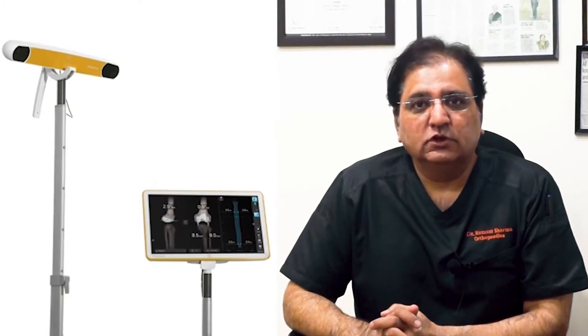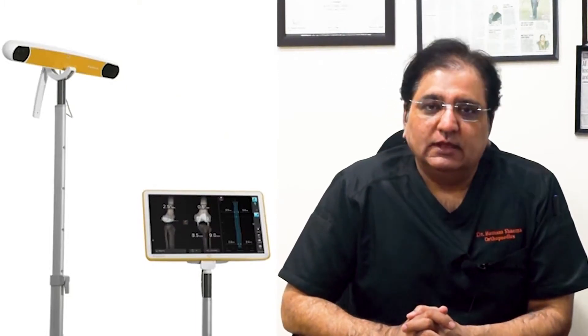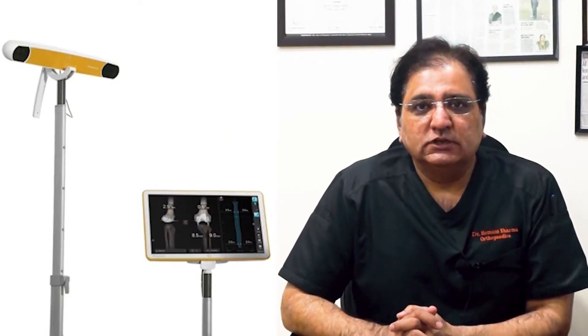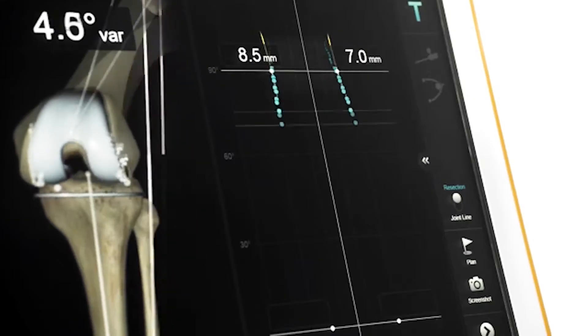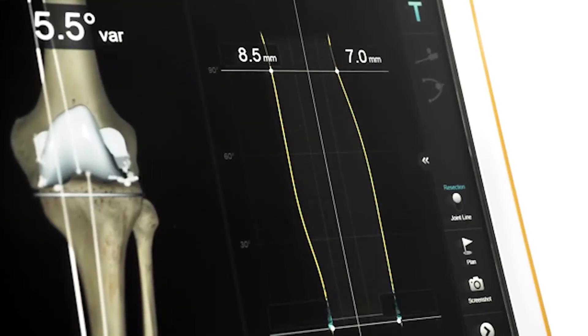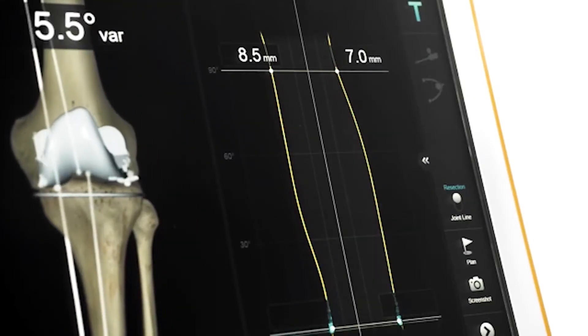We are going to use a Johnson & Johnson computer called Brain Lab. This computer enables us to perform a knee replacement with the help of a Johnson & Johnson implant or another implant. It can also allow us to do a half knee replacement.